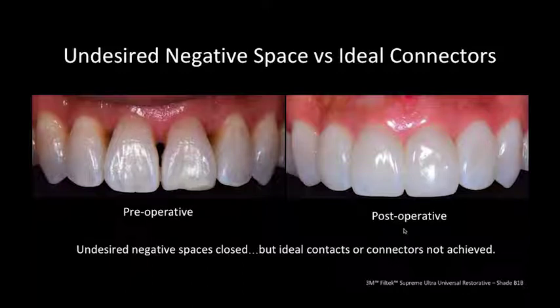the chipped incisal ledges on the two central incisors. But really what you see most obviously are the open gingival embrasures. And then there is some slight coloration issue with a little bit of tetracycline staining causing the amber coloration on the cervical third of the tooth. Now, what the patient was really unhappy with was the open gingival embrasures.